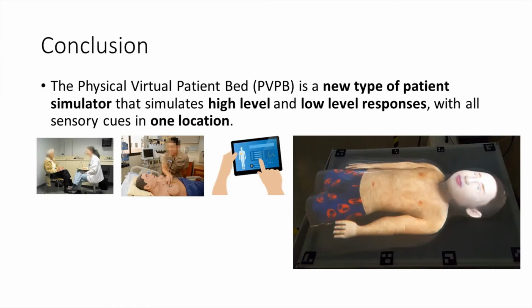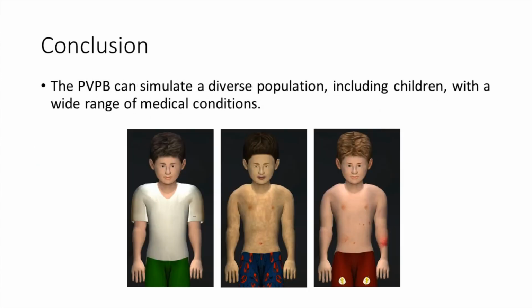In conclusion, the physical virtual patient bed is a new type of patient simulator that simulates high-level and low-level responses with all sensory cues in one location. The physical virtual patient bed can simulate a diverse population, including children, with a wide range of medical conditions.